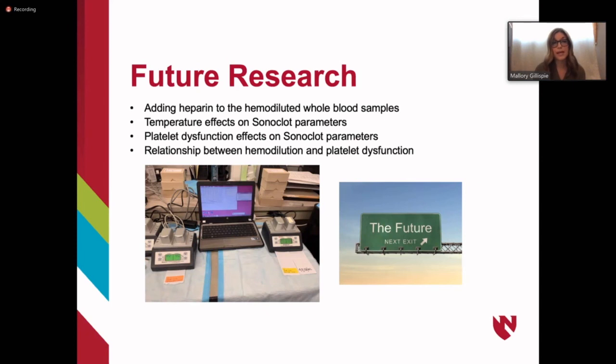Another thing we would like to look at would be temperature effects. We kept our samples at room temperature from the time of collection to the time of the trial. So it'd be interesting to see how hypothermia and even hyperthermic states impact the Sonoclot parameters.